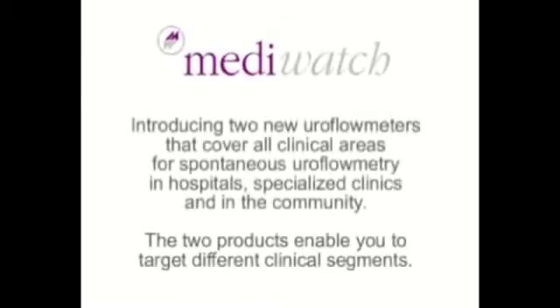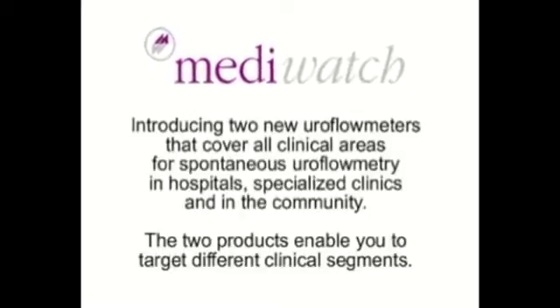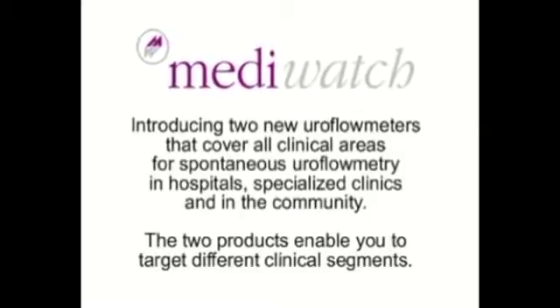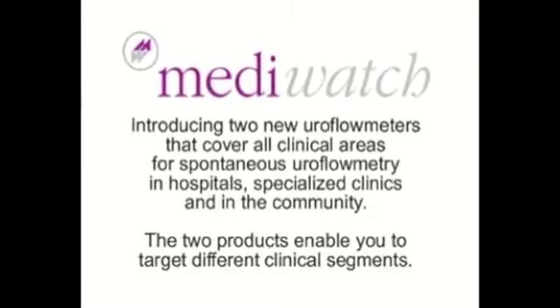MediWatch is introducing two new uroflowmeters that cover all clinical areas for spontaneous uroflowmetry in hospitals, in specialized clinics and in the community. The two products enable you to target different clinical segments.